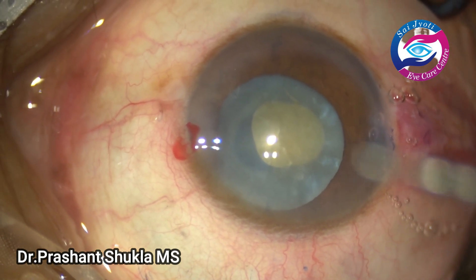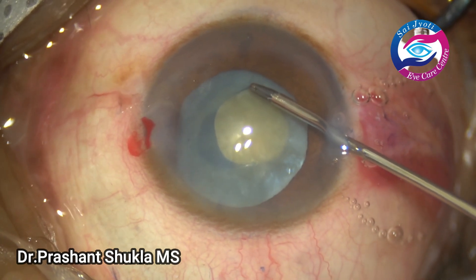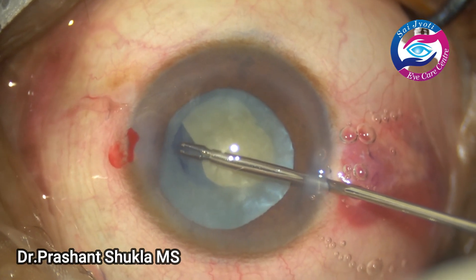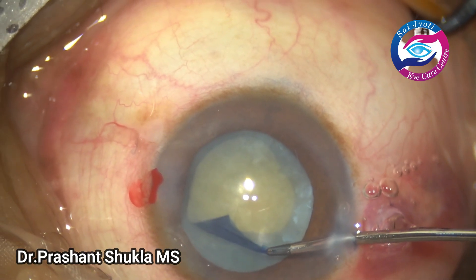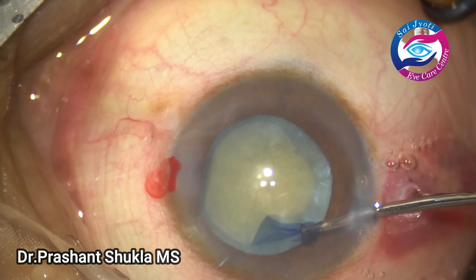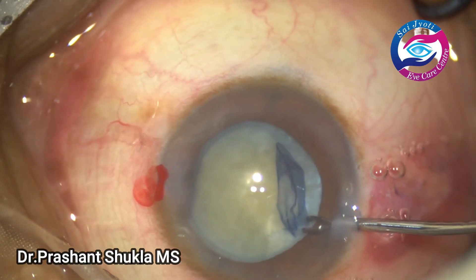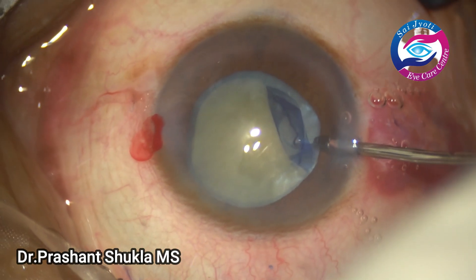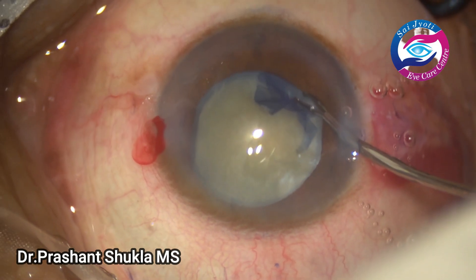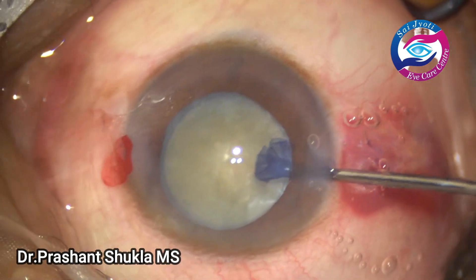A small nick is given tangentially at the rhexis margin and again using the same micro rhexis through the side port I am enlarging the capsular rhexis to an optimum size, considering the nucleus density of about NS3 to NS4. The rhexis is gradually moved along the border of the dilated pupil which is now about 6mm. We now have a decent-sized capsular rhexis.